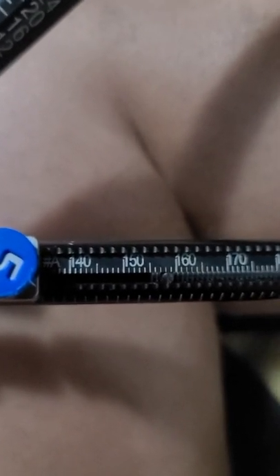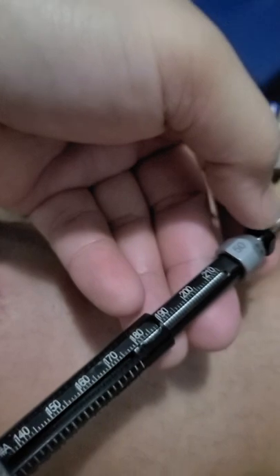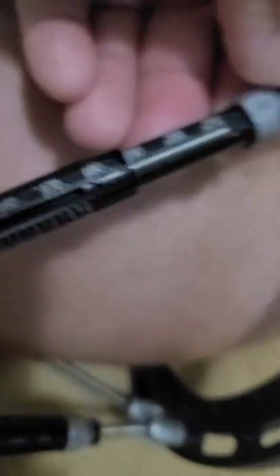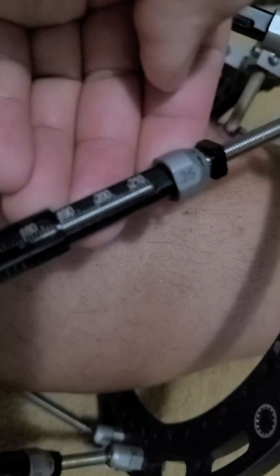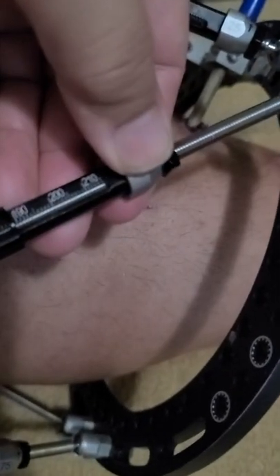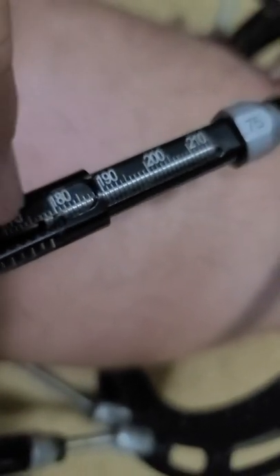There — 158.75. Now I lock it to avoid it from moving or adjusting by itself. Now for number six, we have to go from 181.5 down to 180.75. So that's 181.5 right there, and now going down to 180.75 — marking it there at 180.75.